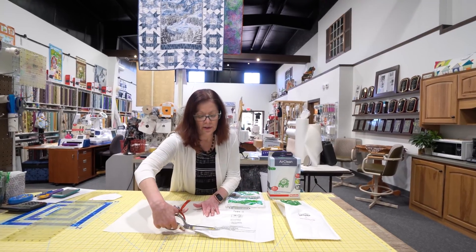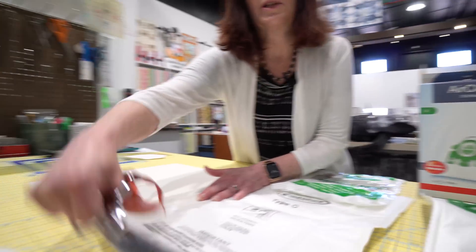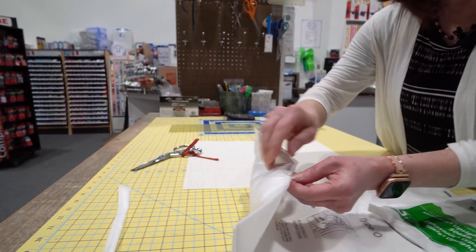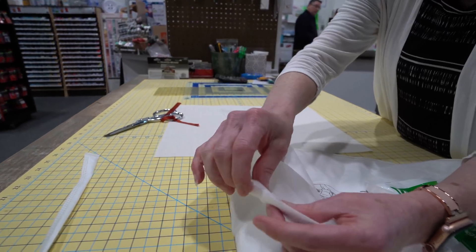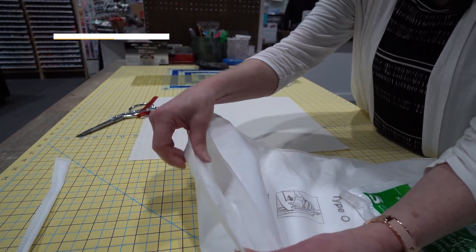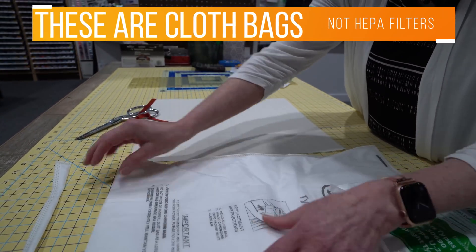So we'll just cut into one of these. What you want to do is just place your pattern on the bag. I just want to show you what's in here — this has a couple of different layers, and if you're wanting to insert a pipe cleaner or something, you could insert that in between those layers.